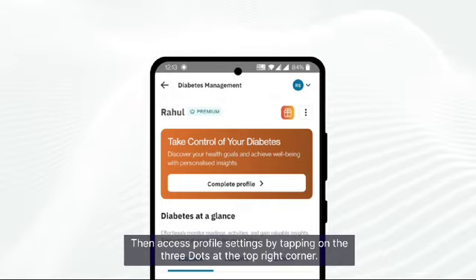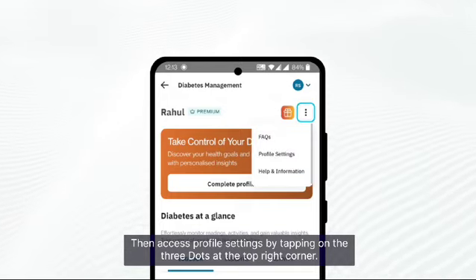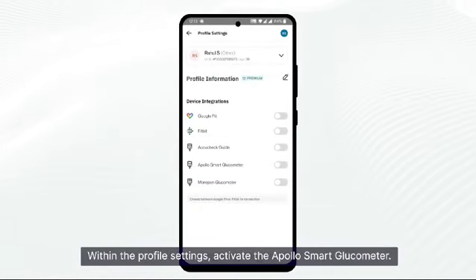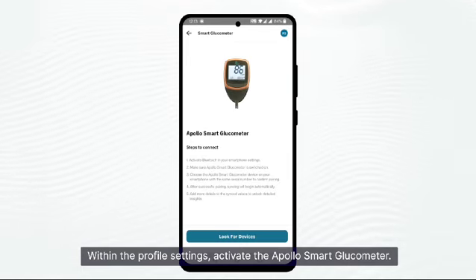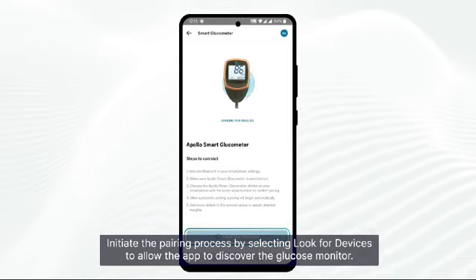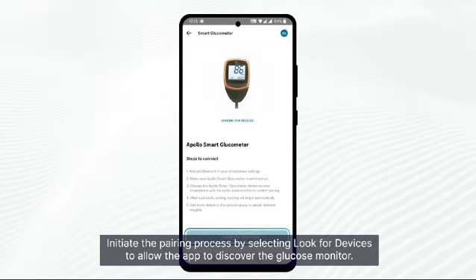Then access profile settings by tapping on the three dots at the top right corner. Within the profile settings, activate the Apollo glucose smart glucose meter. Initiate the pairing process by selecting 'Look for Devices' to allow the app to discover the glucose monitor.